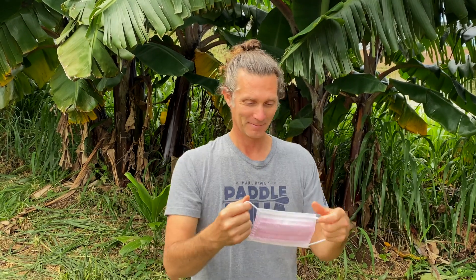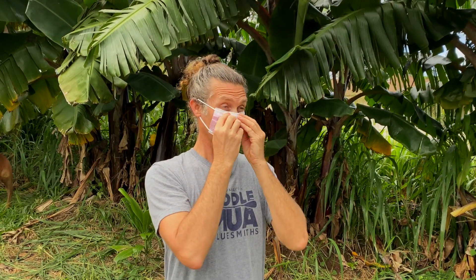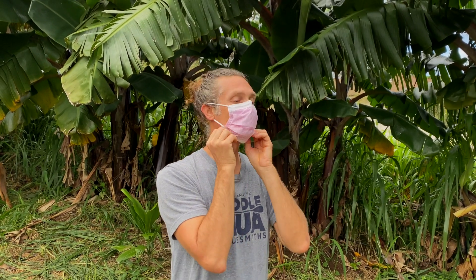After that we get the mask on our face. Specific instructions may vary depending on the type of mask you have. Let's start with the mask that has ear loops. You hold the mask by the ear loops, then place a loop around each ear. Then you mold the bendable edge around your nose to match its shape. Last, you pull the bottom portion of the mask around your mouth and chin.